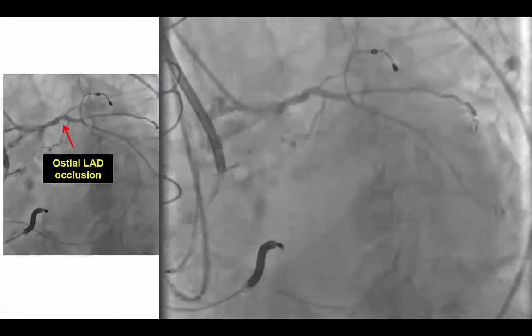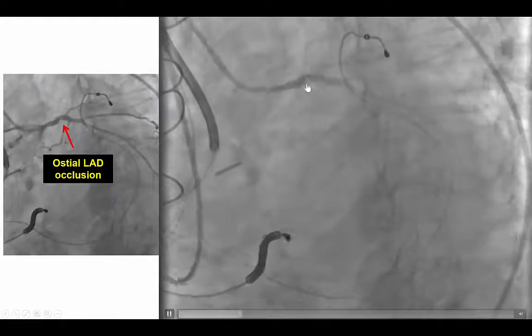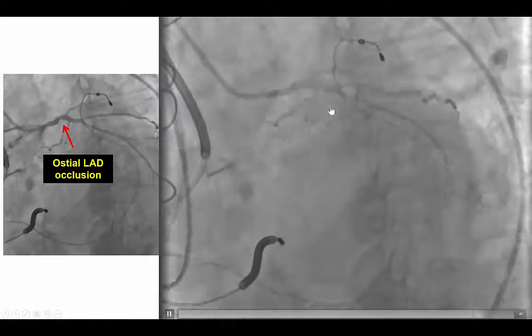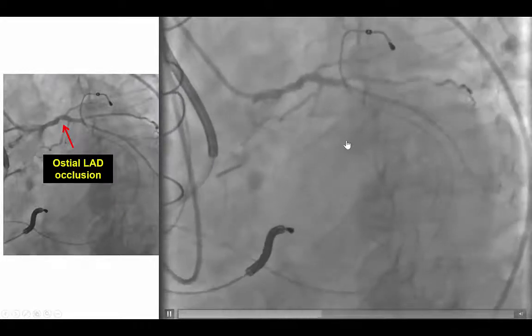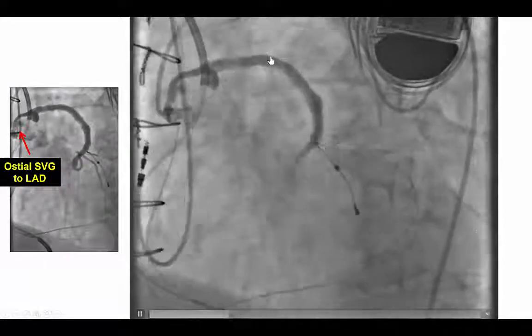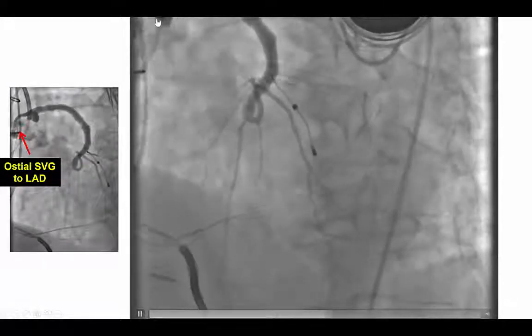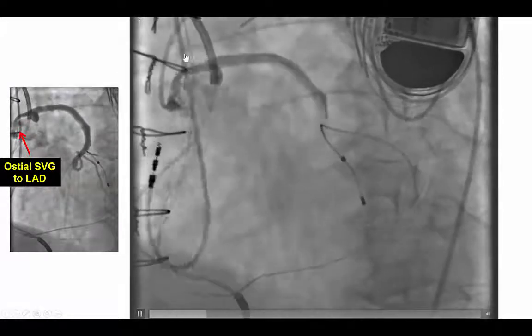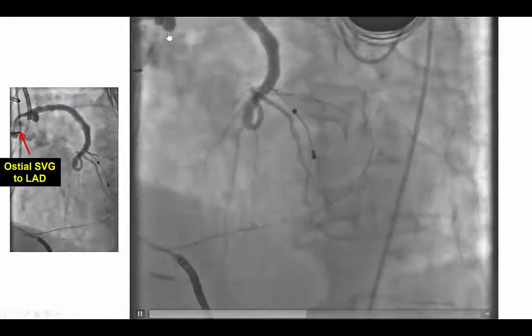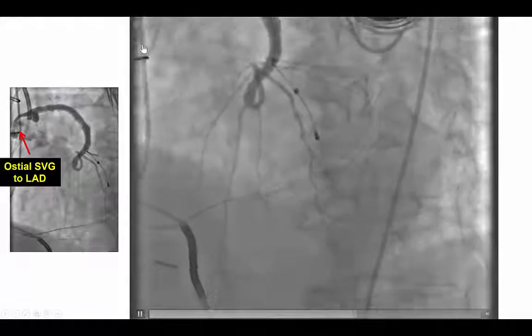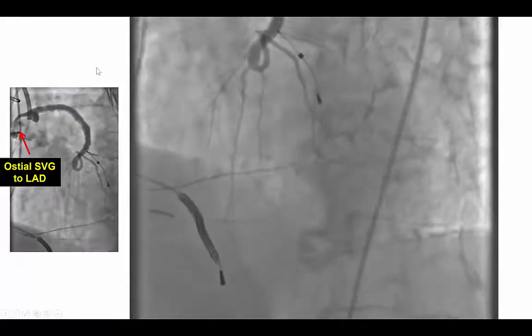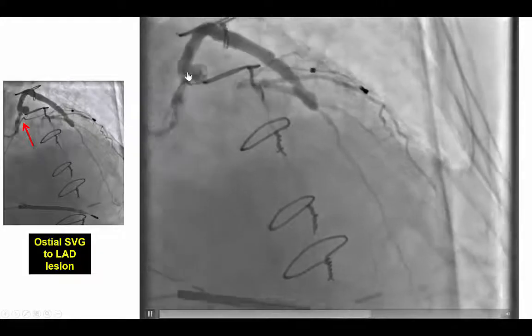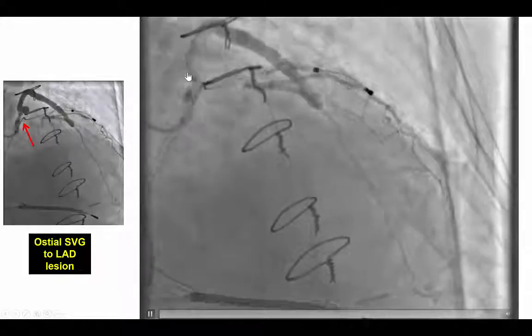The patient presented with unstable angina and was known to have ostial occlusion of the LAD. The LAD was actually filling through a saphenous vein graft that was significantly diseased and degenerated in its proximal portion. There was an aneurysm formation at the proximal part of the saphenous vein graft, with significant disease proximally and the aneurysm in the more distal part of the graft.